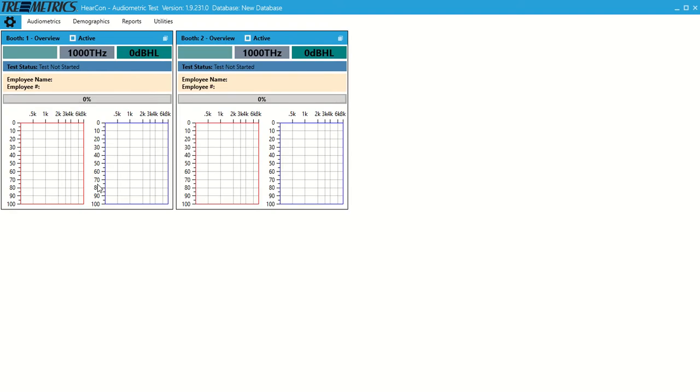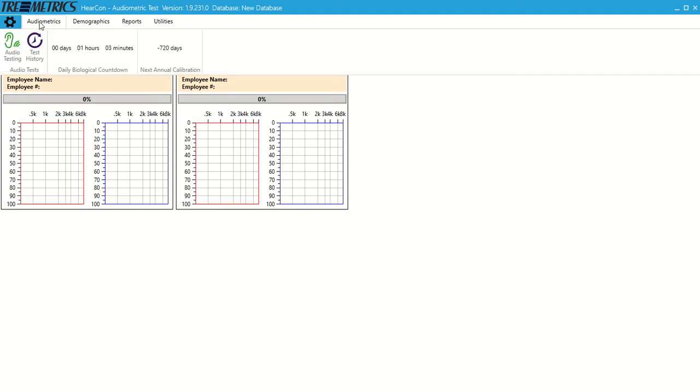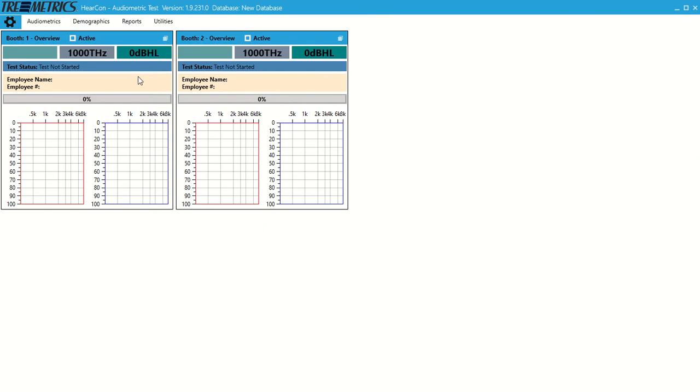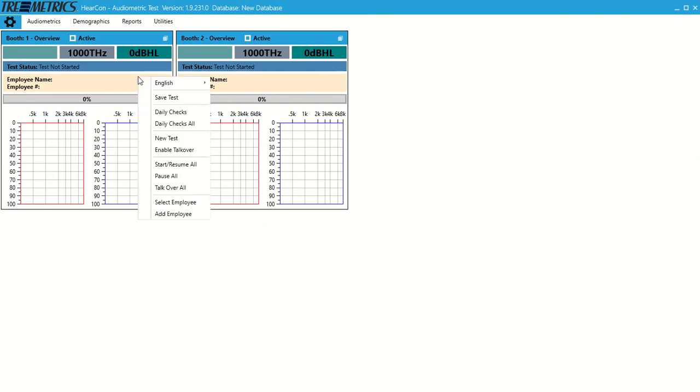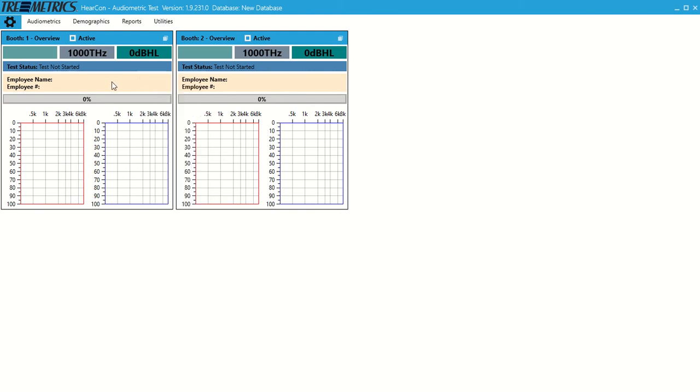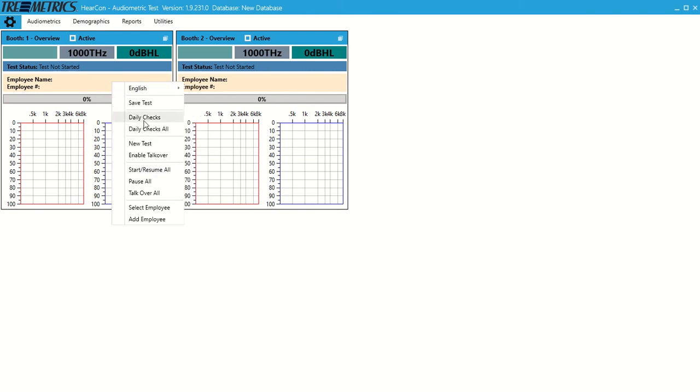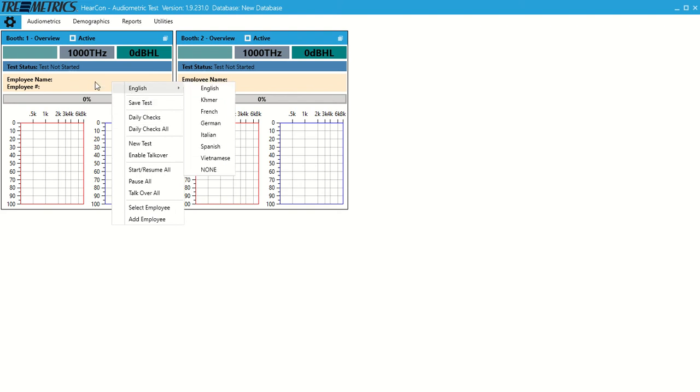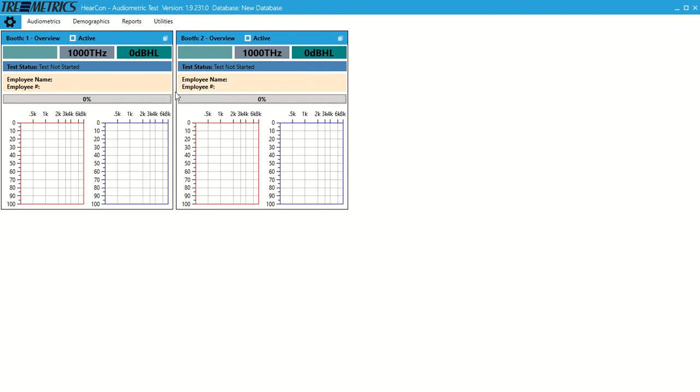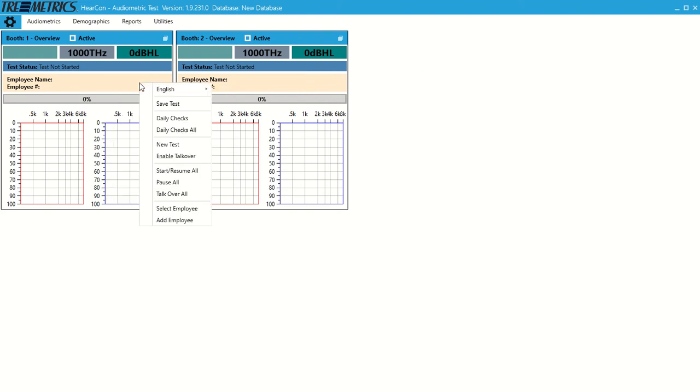This will be our home screen here under Audiometrics, Audio Testing. First thing, if we want to do our daily checks, we can right click. We have daily checks and daily checks all. Daily checks would be for just the audiometer you were hovering over, so for us it was the audiometer on the left. Daily checks all would be for every audiometer you have plugged in. So we'll go daily checks all quick.